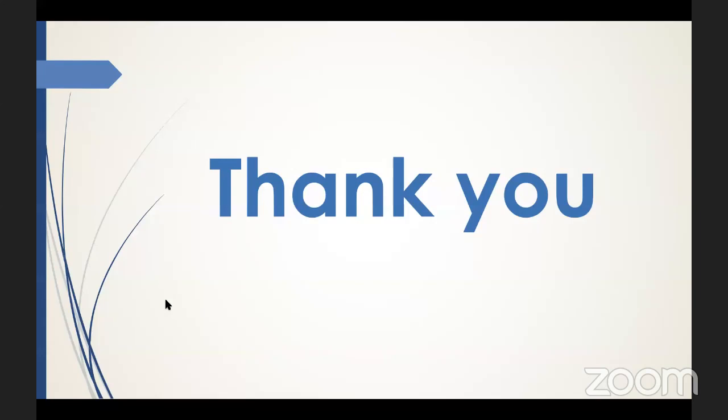Good. Another question here: should grading be mentioned in the report? It's quite useful to mention it, but sometimes, like I said, the referrer would take action anyway, either for mild or significant reflux. So it's very good to mention it and to have your comprehensive report handed in.